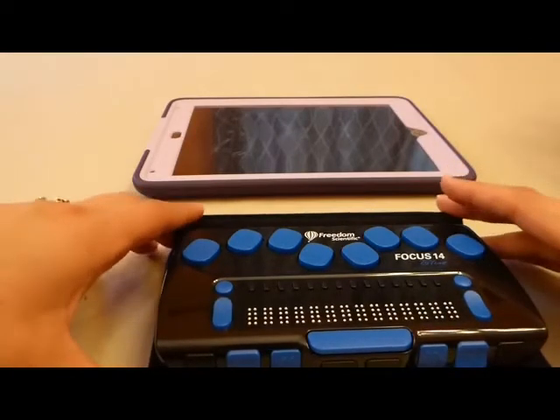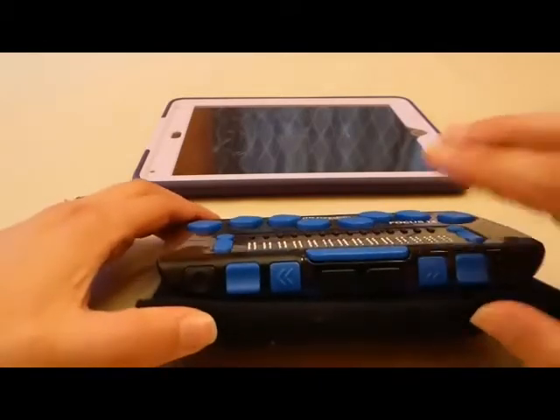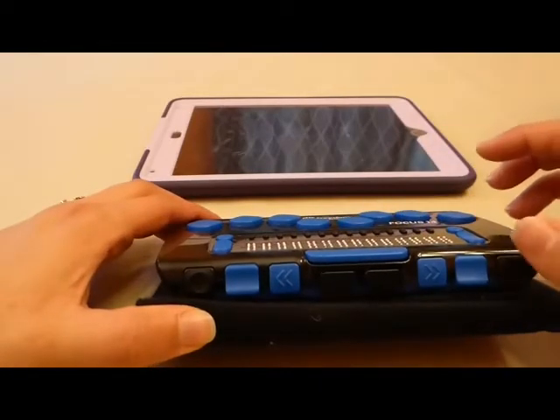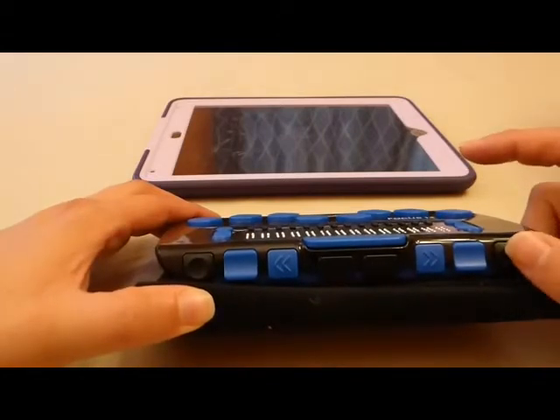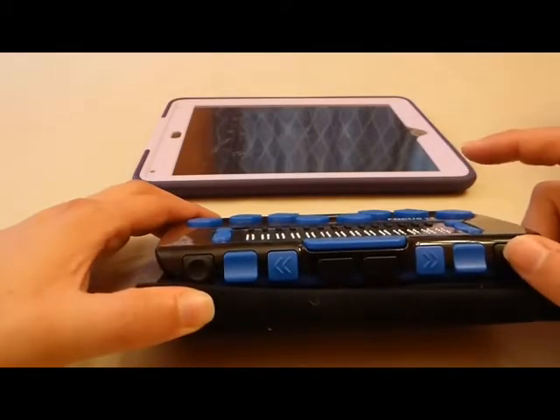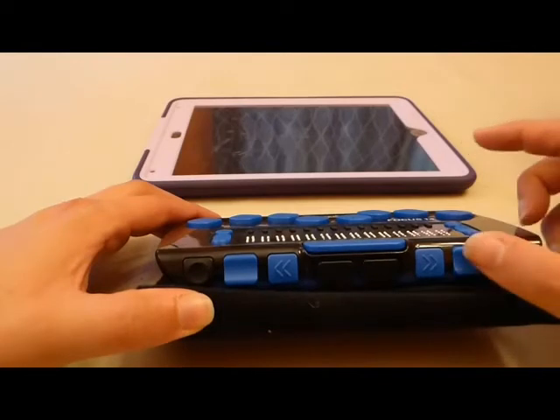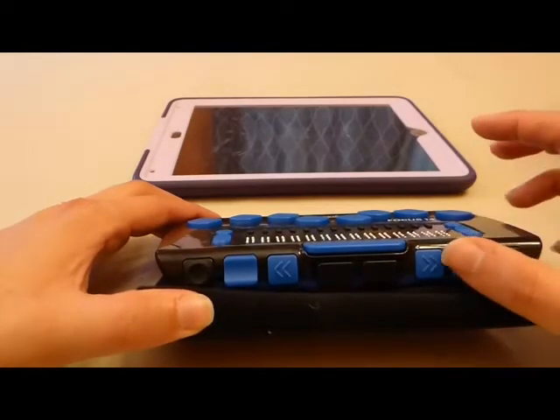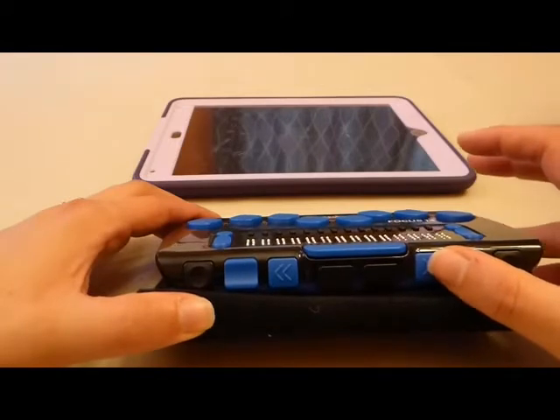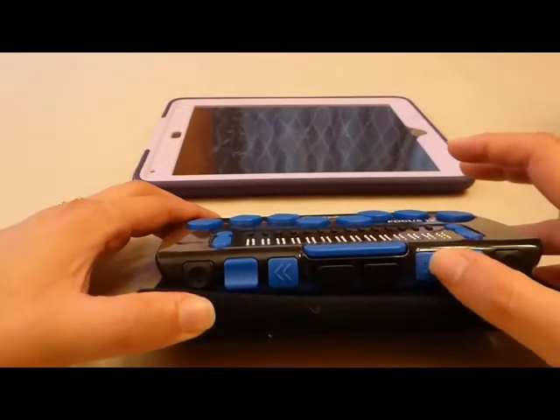Now, if I turn my Focus upwards so that you can see it, I'm working on the front panel that faces you while the Focus is laying on the table. Moving from the outside in on the Focus 14, I find a selector button that is shaped like a concave circle. Then I find a rocker bar. Then, as I continue to move inward, I find my panning button, which has an arrow shape on it.